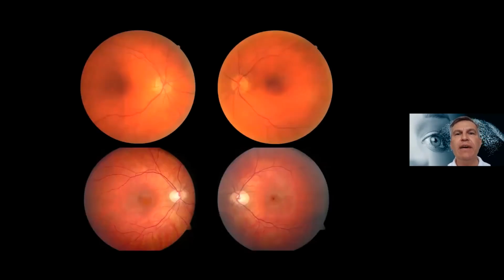Here again, top level was the father, and in the lower you see the optic disc, which is pale, and the macula, which is not normal. So we use different possibilities to image the eye, and not one will give you the answer, but sometimes you need several ones. So this was imaging of the structure.